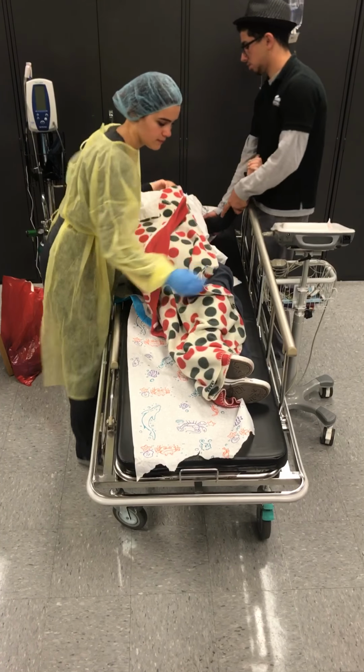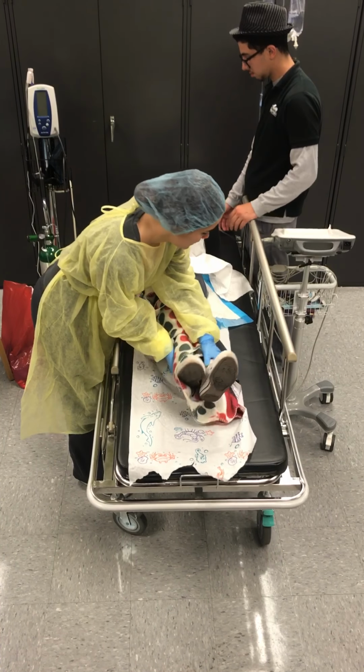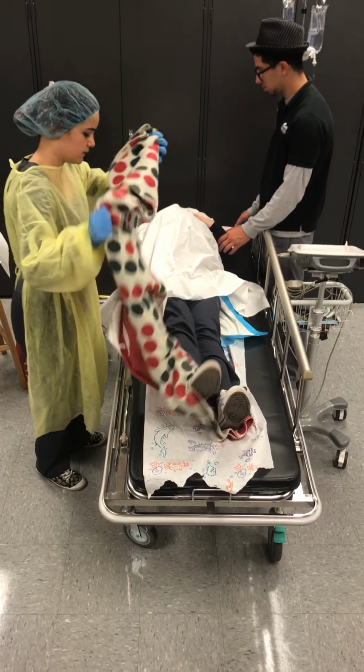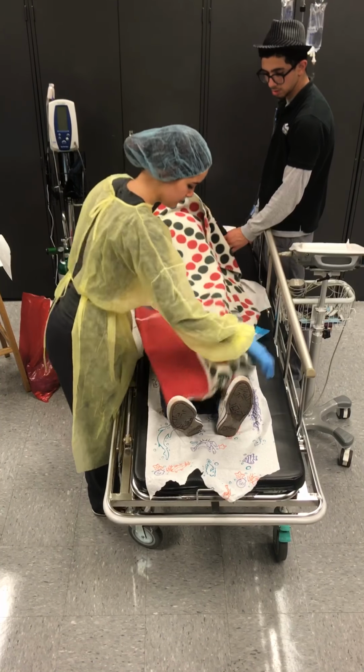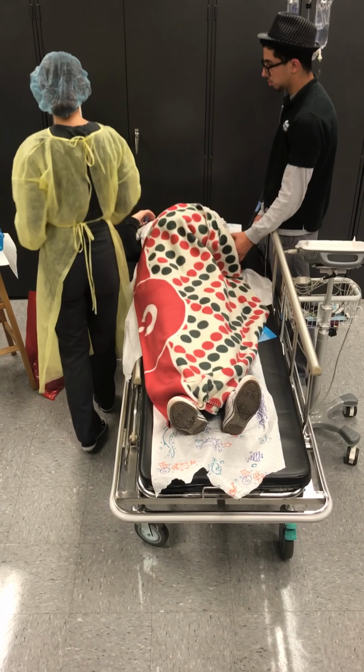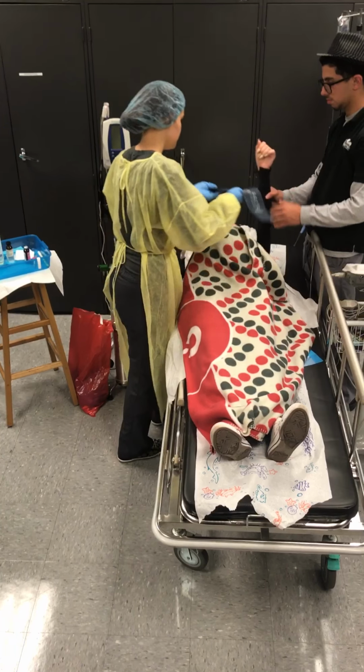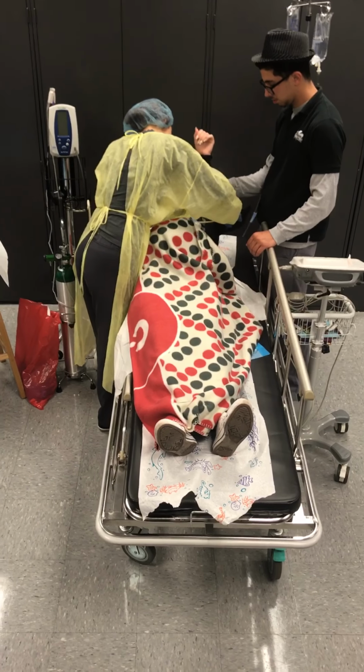Monitor vital signs. Okay, perfect. Just put this up. Cap CSF specimens tightly.